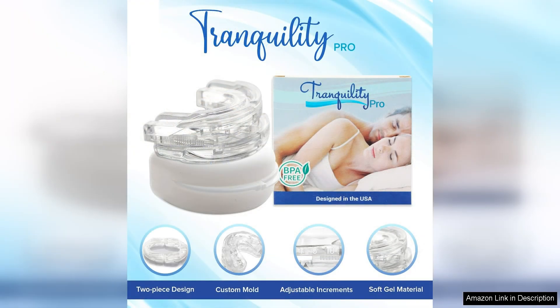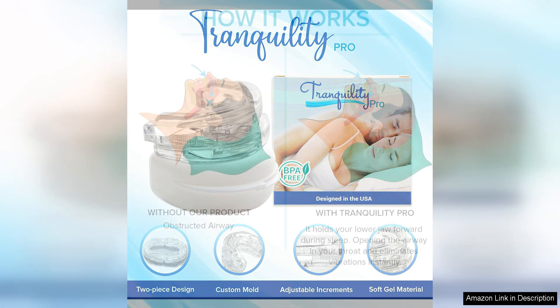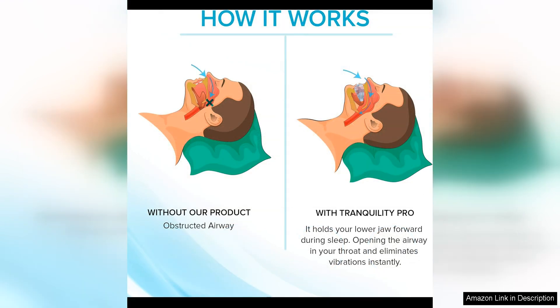One of the key features of the Tranquility Pro 2.0 is its adjustability. The mouth guard can be easily customized to fit your mouth comfortably, ensuring a secure fit throughout the night. This is a major advantage over other anti-snoring devices that may be one-size-fits-all or less comfortable to wear.